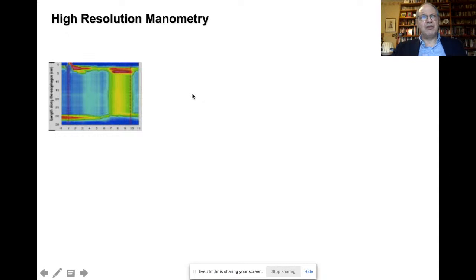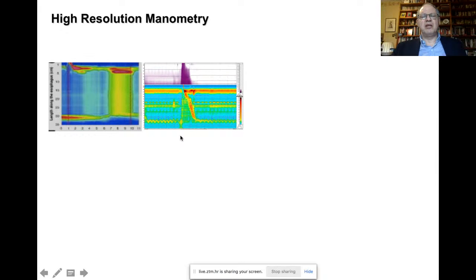some patients have reflux symptoms in the context of achalasia. Another possibility is that the patient has regurgitation, and when we look at the manometric combined impedance study, the patient had a pattern of rumination.